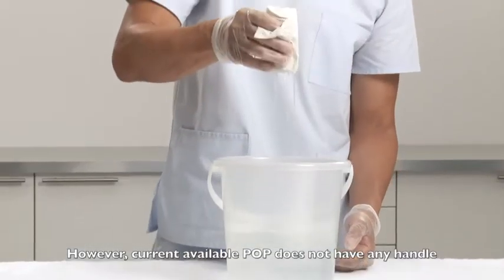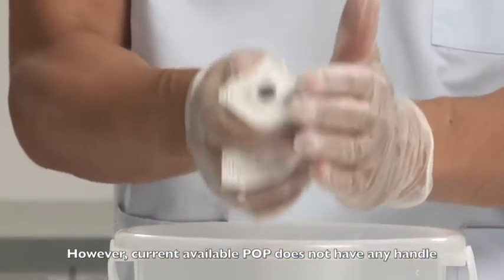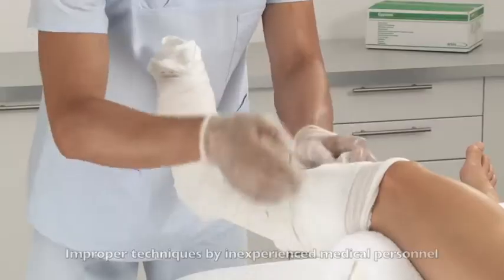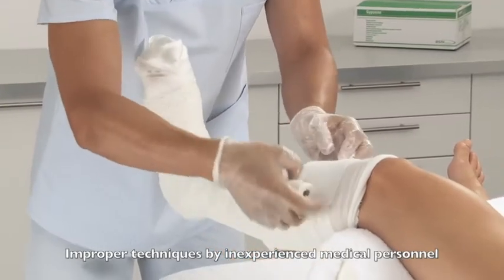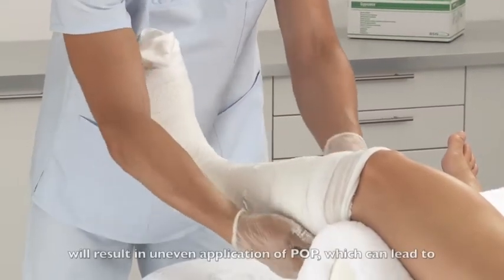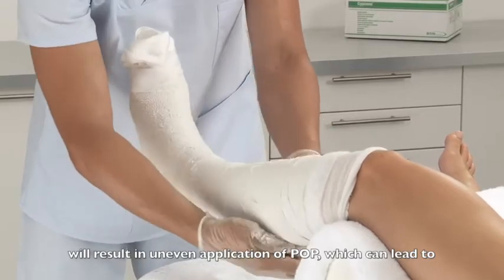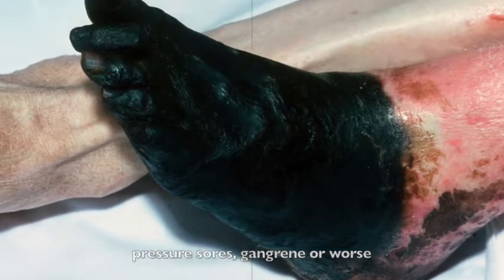However, current available POP does not have any handle, so the doctor has to hold and apply it with bare hands. Improper techniques by inexperienced medical personnel will result in uneven application of the POP, which can lead to pressure sores, gangrene or worse.